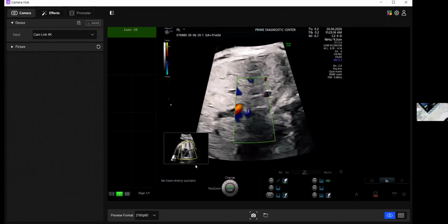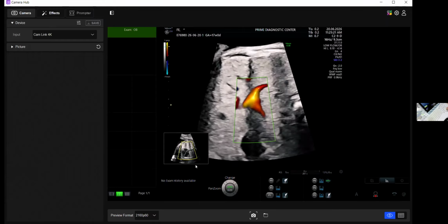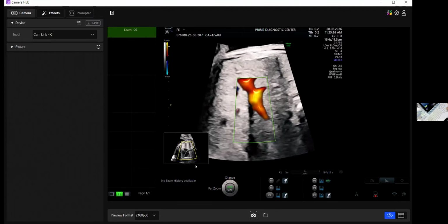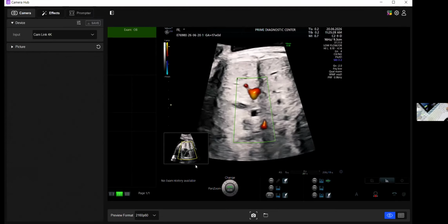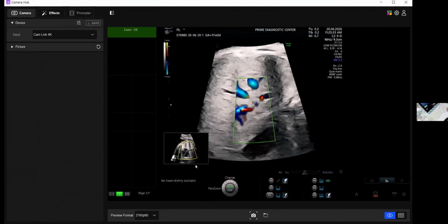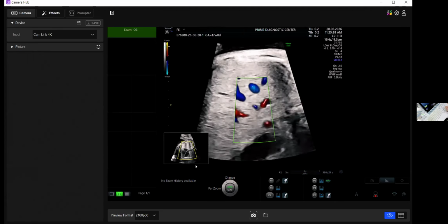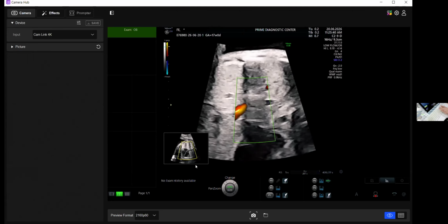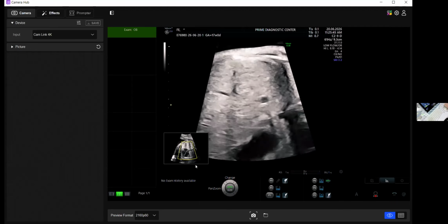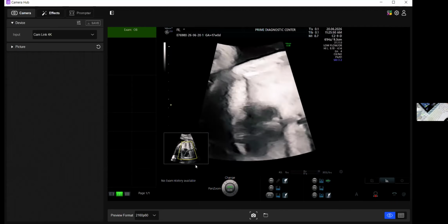Because one of the reasons for dilated RA and RV could be an absent DV and the umbilical vein draining into the inferior vena cava or the right atrium directly. But I think I'll come back to that again. Maybe I'm not getting the right view. I'll go to sagittal later and try to figure out. At least it's not opening into the right atrium. So the RA and RV dilatation is unlikely due to a DV shunt.